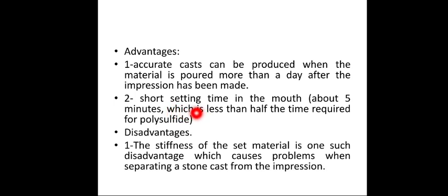Setting time is short, so it is less uncomfortable and gives less irritation for the patient. The disadvantage is that it is stiff when it is set. It makes it impossible to release the stone cast from the impression.